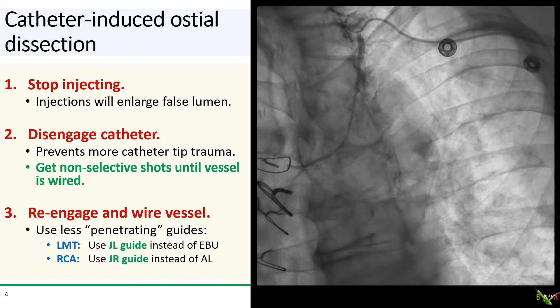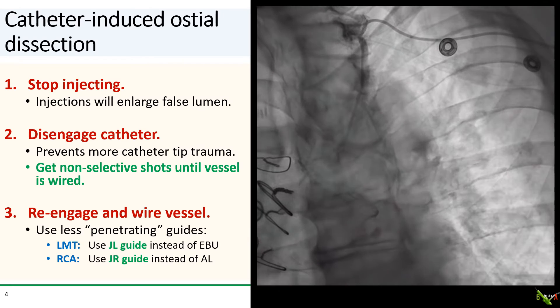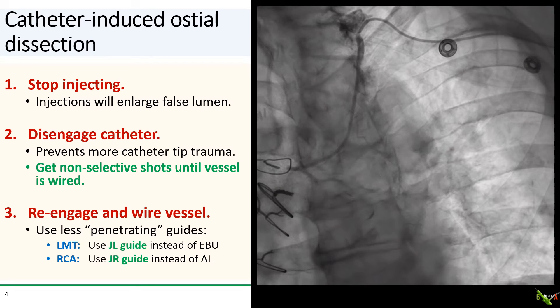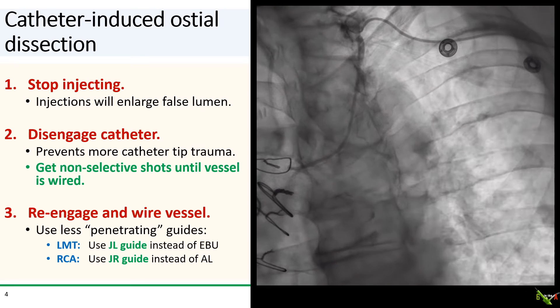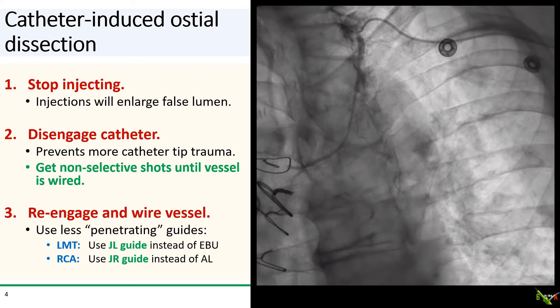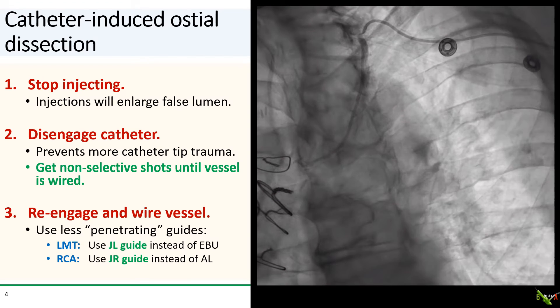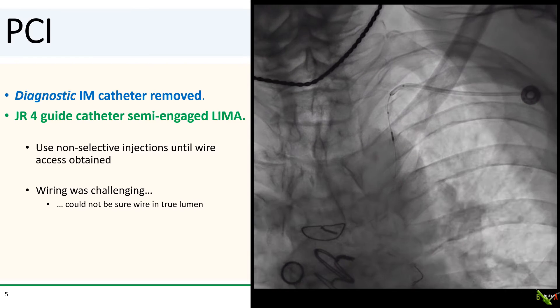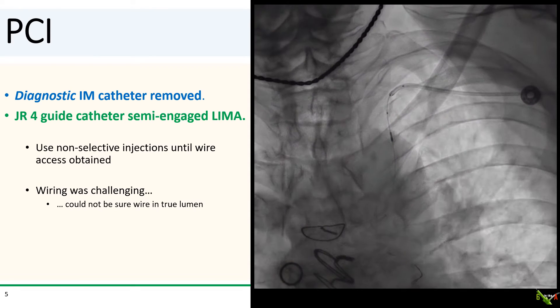Third, gently re-engage the vessel and try to get a wire down. For ostio-dissections, I suggest changing to a guide of a different shape to minimize repeat trauma. A less forceful guide that is easily disengaged is ideal. For the left main, go for a JL guide. For the RCA, use a JR guide. For grafts, including the LIMA, you might consider using the JR guide as well. In this case, the IM diagnostic catheter was exchanged to a 6 French JR4 guide, and until there was wire access to the LIMA, non-selective injections were used to reduce the possibility of further enlarging the false lumen.